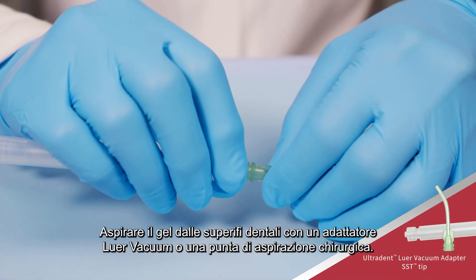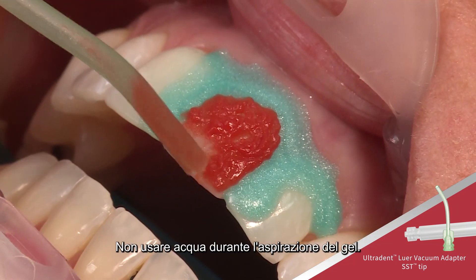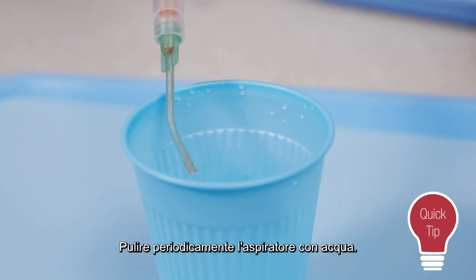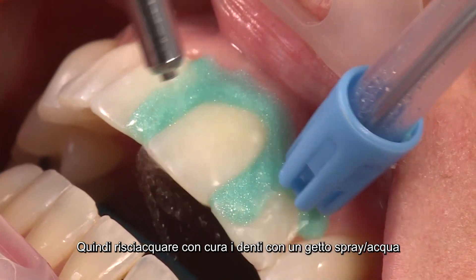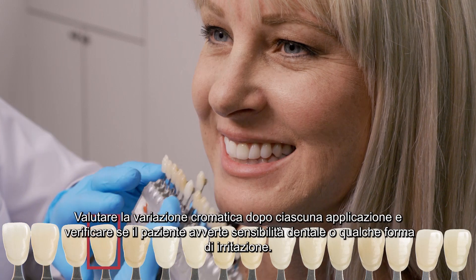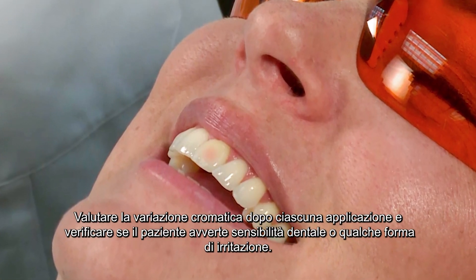Suction gel from teeth using the Luervac adapter and surgical suction tip. Do not use water while suctioning gel. Clear suction periodically with water. Then thoroughly rinse teeth with an air water spray. Evaluate shade change after each application and monitor the patient for sensitivity and irritation.